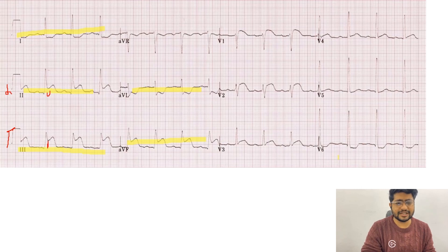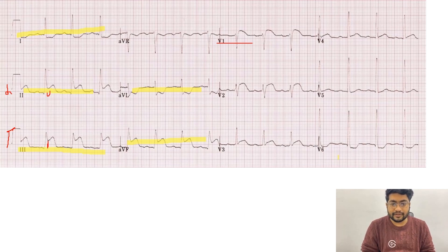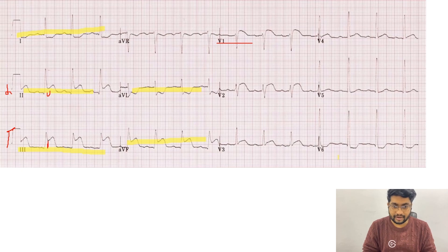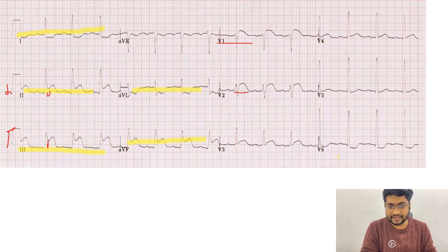The next criteria is that we should have elevation in lead V1, because lead V1 is placed on the right side of the sternum — almost in line with the right ventricle — so elevation of V1 describes RV infarct. Our third criteria is that V2 should show ST segment depression. In this ECG, however, we are not fulfilling this third criteria.